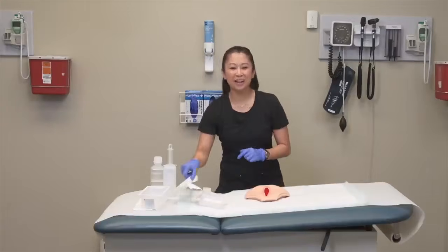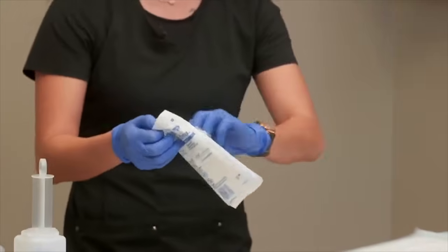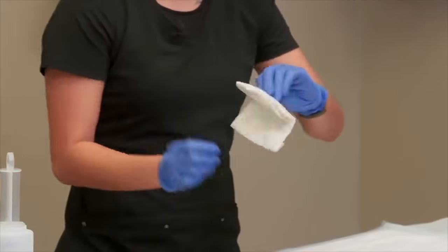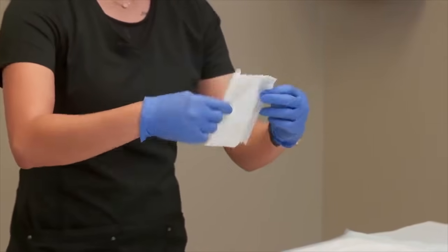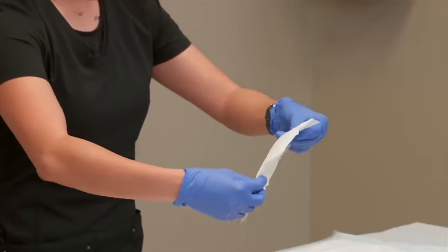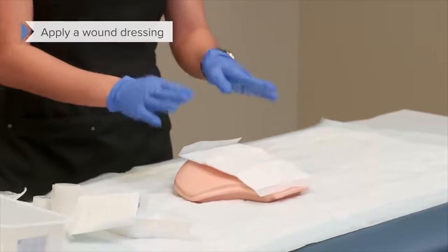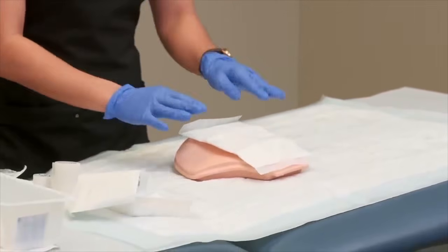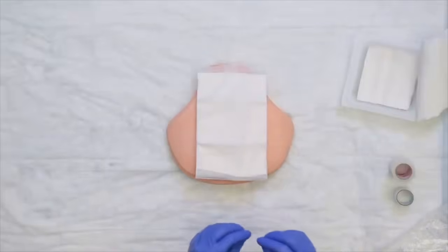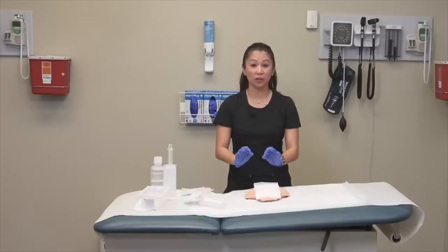Okay, so I'm going to take my dressing and open this up, and I'm using an ABD pad. When I open this up, be conscious not to touch the inside of the dressing, and I'm going to put this flat. The good thing here is once it's covered, we're pretty safe. Sometimes it's hard to handle tape or the dressing, but as long as you're covered here, we're good to go.